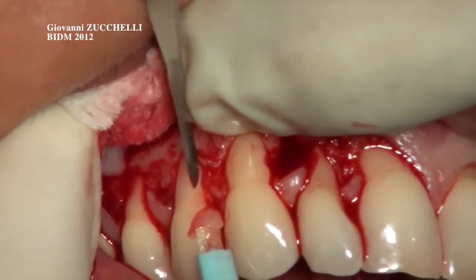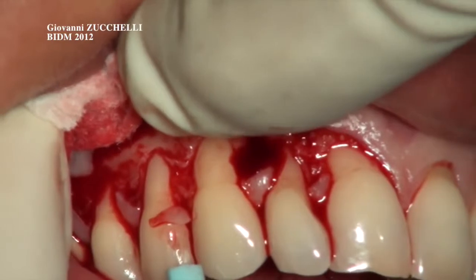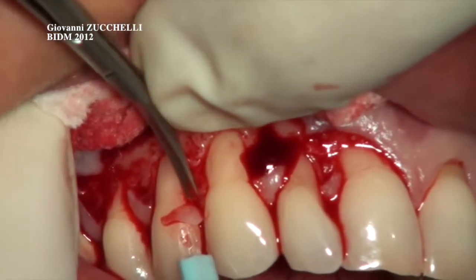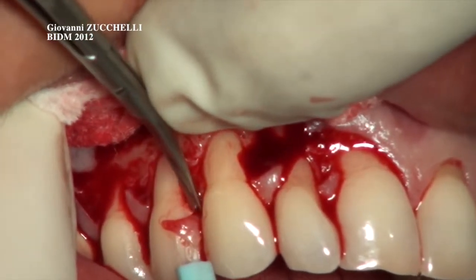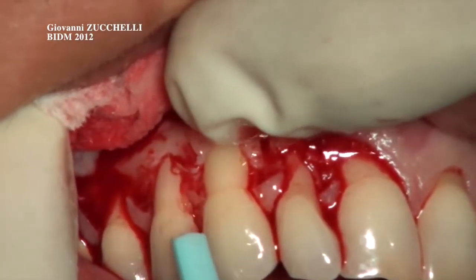You can see the epithelium, and the connective tissue that is left in the papilla. And now it's time to get the microsurgical blade to complete, along with this incision, the papilla desepithelialization until the tip. And when the tip is desepithelialized, the epithelium is suctioned. Now we do the same thing for the other papilla.